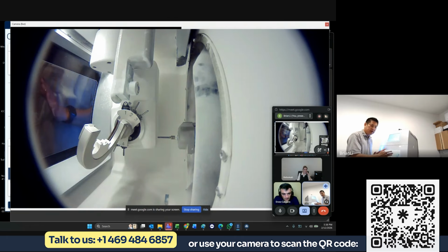And the reason we do that is because if something goes wrong and you call the help desk, they can now remote in and say, hey, you know what? Open your TeamViewer. Let me take a look and see what happened. Instead of getting on the phone, calling the help desk, hey, I have a problem. Oh, what seems to be the problem? Well, I was milling this.